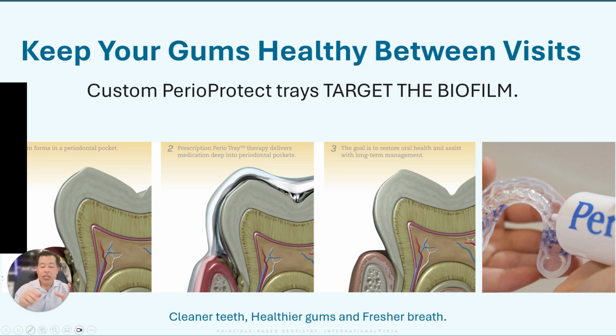It's custom made. You take a scan of the teeth going about 4 millimeters beyond the junction of the soft tissue and tooth. So you extend into the soft tissue areas. These are designed and then fabricated and sent back to your offices, usually, depending on where you are, in less than a week. But basically, it forms a gasket, a tight seal in the sulcus area of the tooth. So you put this gel, the Perio gel is 1.7% hydrogen peroxide, into the tray. You seat the trays up on the upper arch and lower arch.